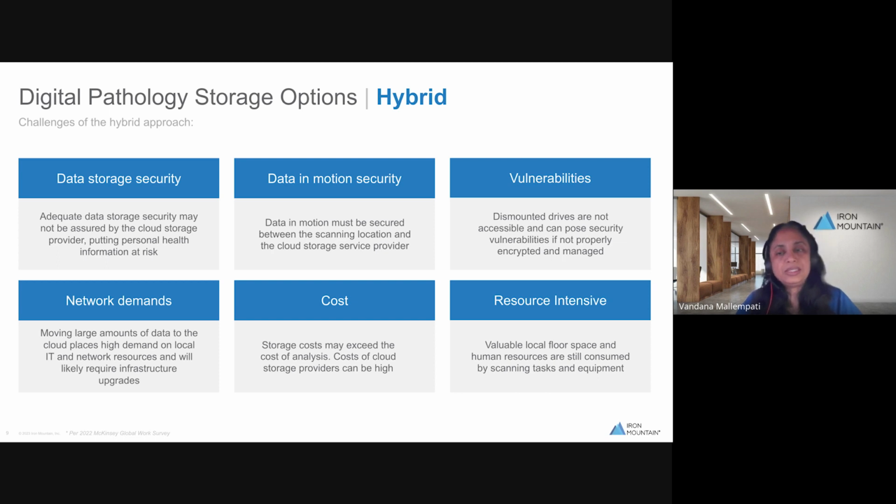Cloud storage is essentially limitless, but it's not free. The organization's cost will need to be modeled and understood to ensure scalability, and also take into account the egress and ingress fees associated with frequent access of the data that is stored in the cloud.